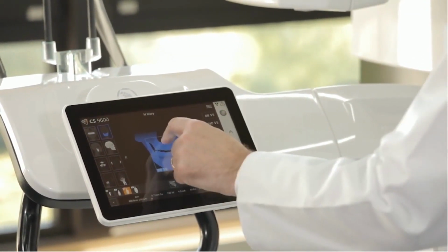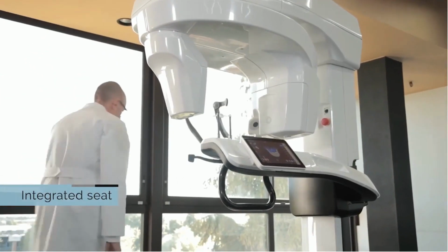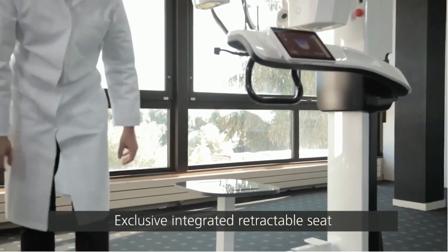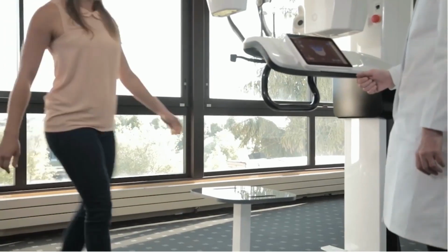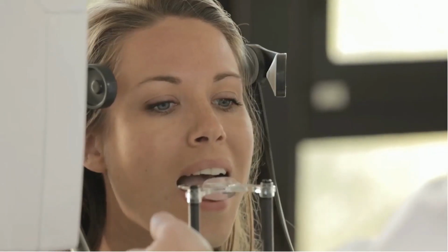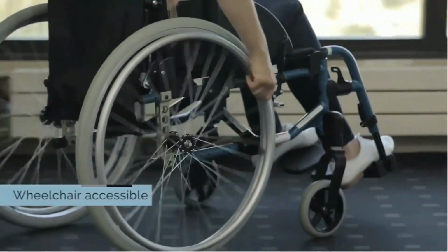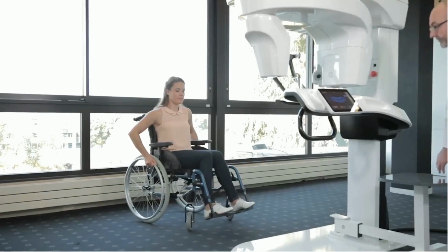It's very important to avoid movement of the patient during the CT scan because the movement of the patient results in a motion artifact, and this can impair and jeopardize our ability to make the proper diagnosis, for example, particularly in case of small structures, small endodontic lesions or periodontal lesions. And so it's important to have the patient comfortable, and the patient doesn't have to move.